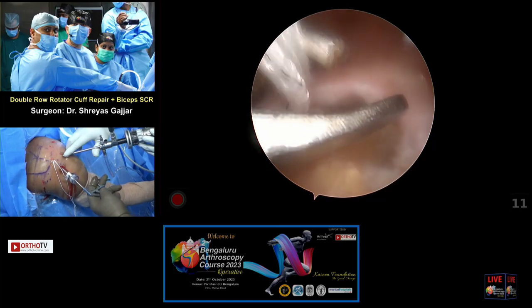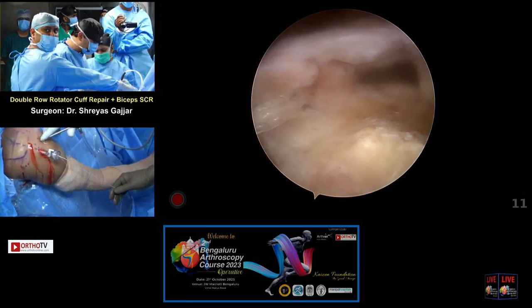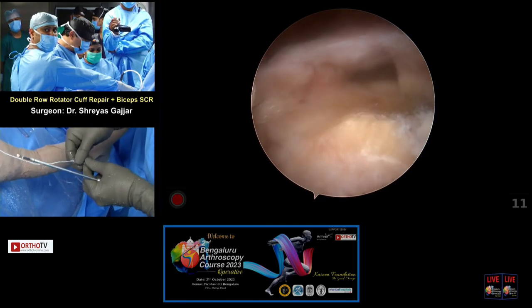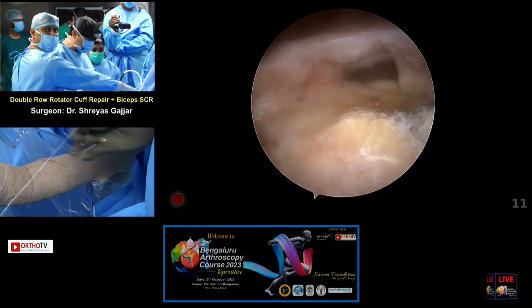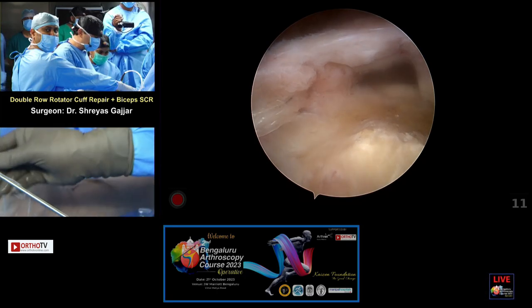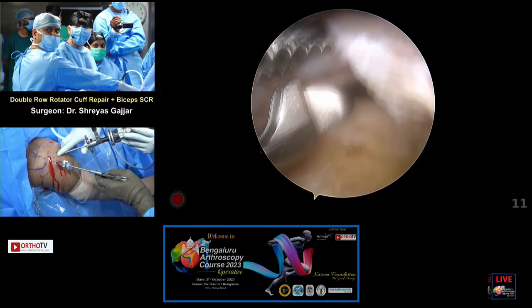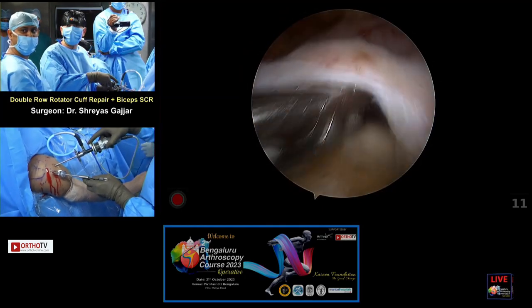This is a low profile tape retriever. So we retrieve the tapes. Now can I have the scorpion, please? Akshay, do you mind holding this? Thank you. If you can see the outside image, the two tapes are merged, so it just saves a step. I like to pass the medial suture at one point rather than two points. Some prefer to do it at two separate points. You pass the scorpion, and posteriorly you don't have the biceps, so you don't need to worry. You can go freely in.